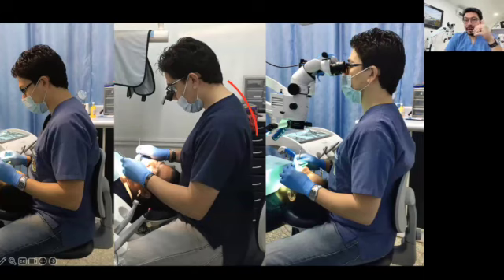And the microscope will change your position. But with the regular microscope with the binoculars, you need to stay straight in the same position all the time, which is good, but we are not going to be free enough for performing some treatments.